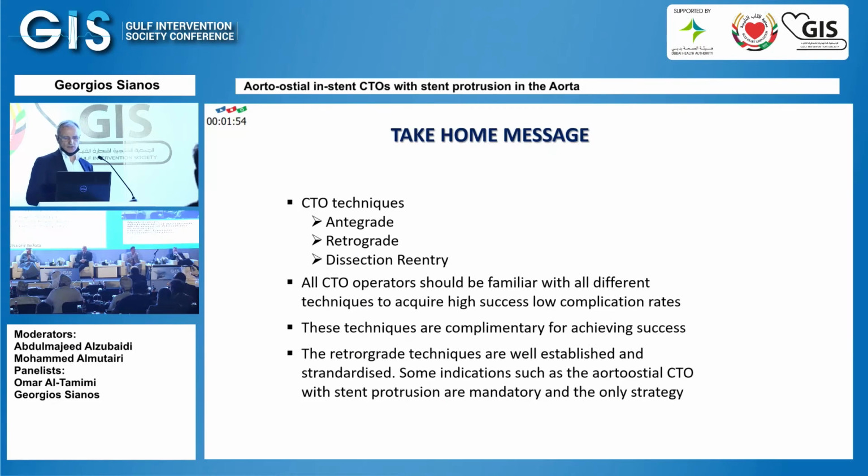So the techniques are complementary, and the retrograde techniques today are standardized, and we should apply them in cases. And in these two cases that I presented to you, I think the retrograde application was the only solution available.